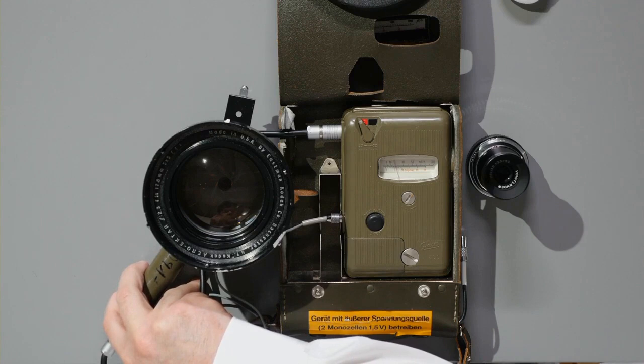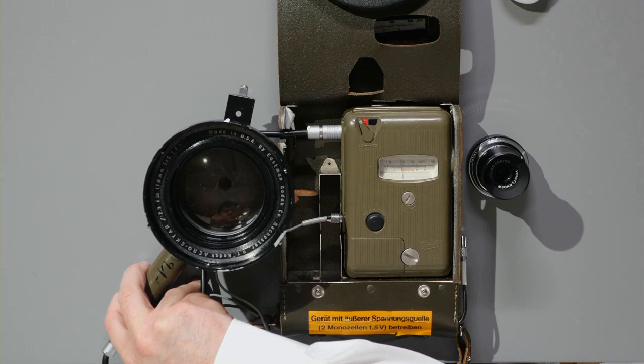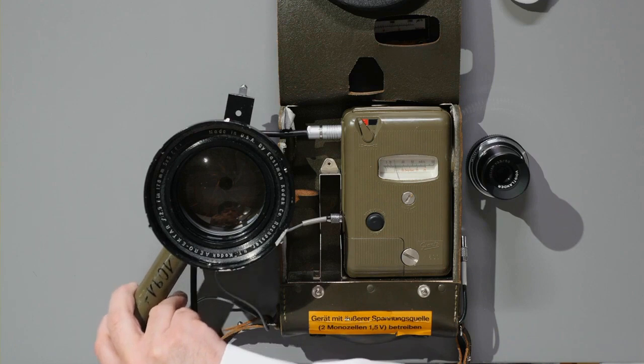We're reaching 20 pulses per second. Look, almost 30. Now we're at the center of the lens, a little less.